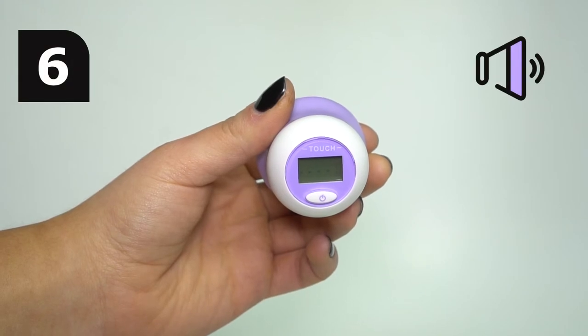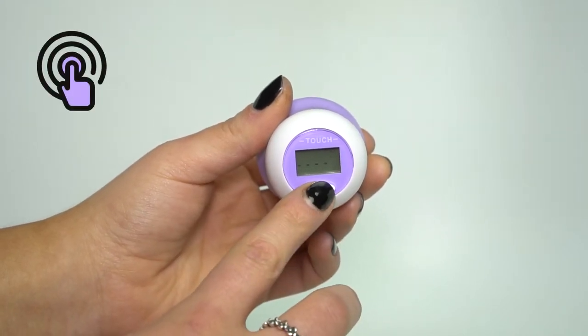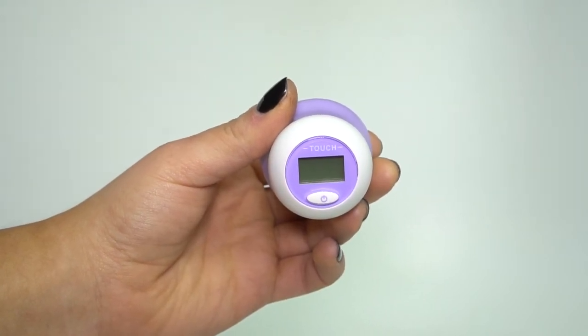then six consecutive beeps will be heard. Press the on/off switch to turn off the thermometer, or the unit will switch off automatically after approximately 60 seconds.